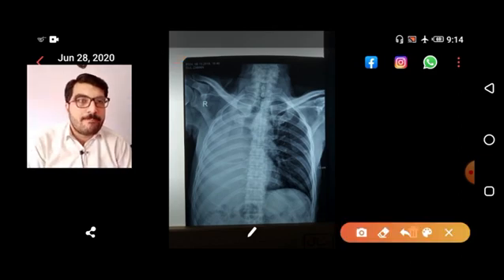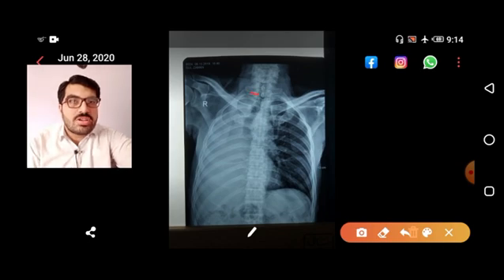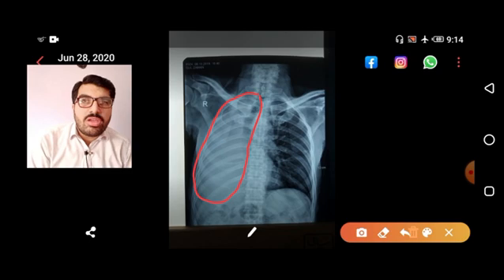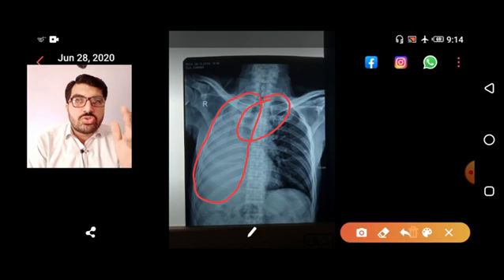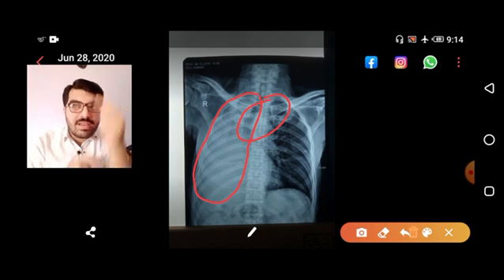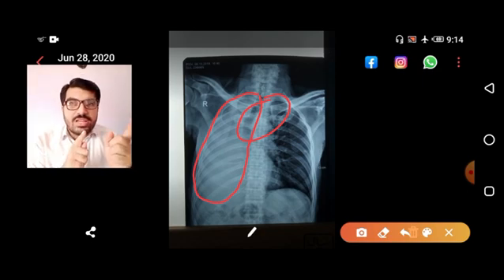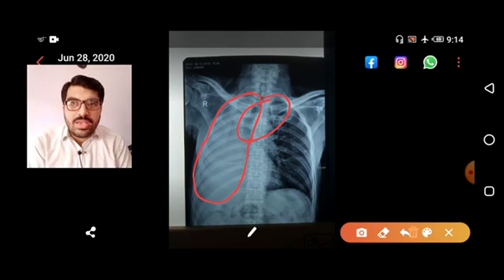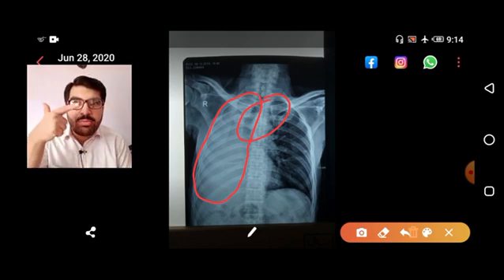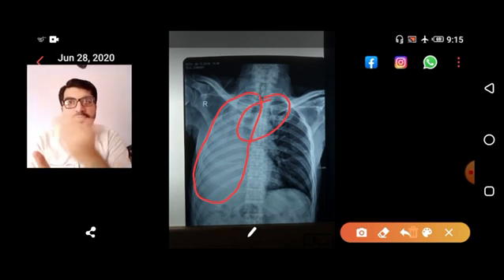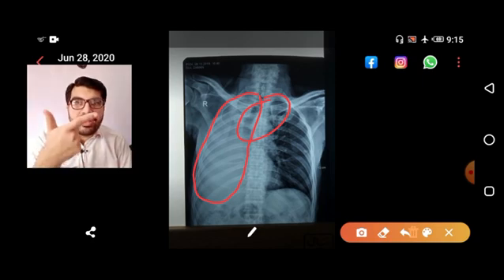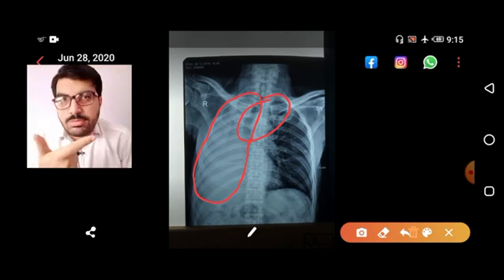Looking at this X-ray: there is complete white-out of the right lung, and the trachea is shifted toward the right. Complete white-out with tracheal shift to the same side gives us two differentials — point one: lung collapse, and point two: previous lung surgery such as pneumectomy.